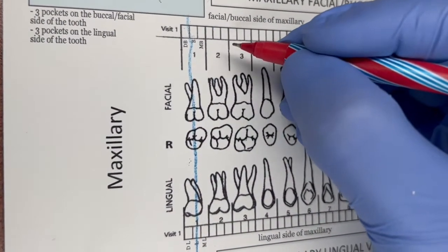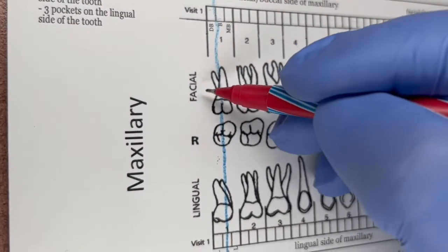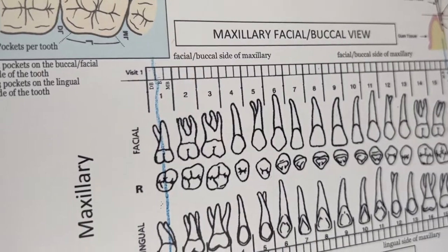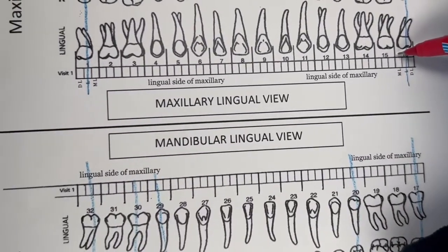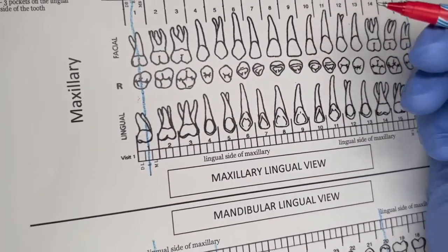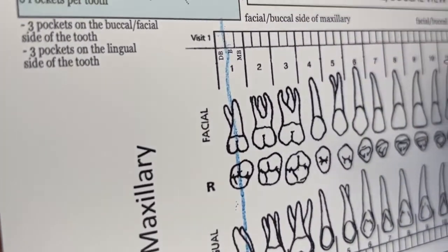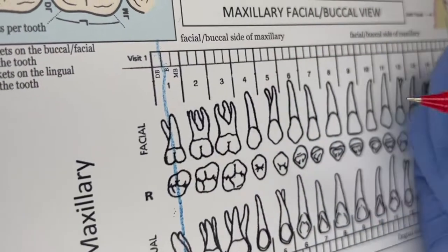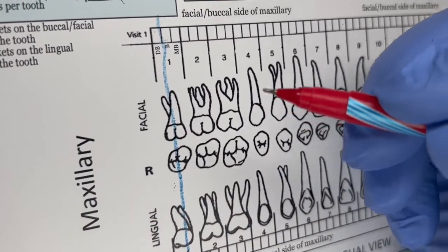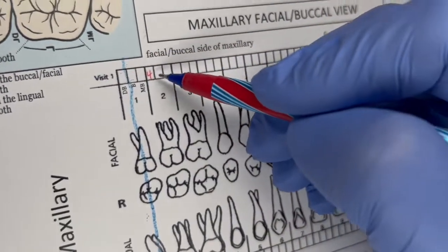Now the hygienist is starting her probe reading. She's going to do all the facials of the maxillary and go all the way across. We start with the distal buccal of number two because one is missing. The readings are: 4, 3, 4.